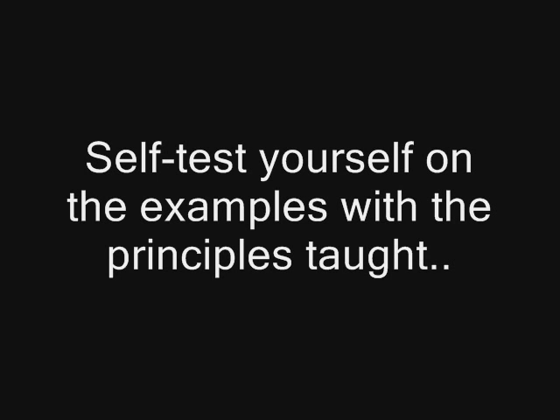There are 3 sessions, and in them I'll go through the basics of 12-lead ECG interpretation, ending up with a whole series of examples that I'll talk you through in a systematic way. The systematic interpretation is very important. And when you finish the workshop, and remember you can replay each session as many times as you want until you've got the principles, I'll give you a self-test. You can look at the examples and work through the principles I've taught you and then look at the answers. So if you're ready, I'll go through what each of the sessions entails.